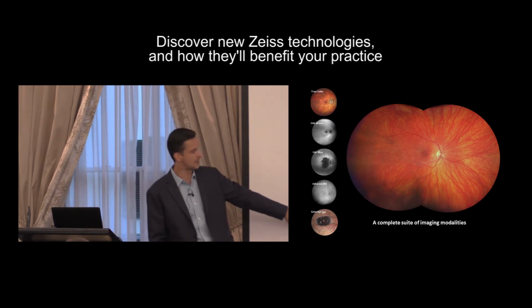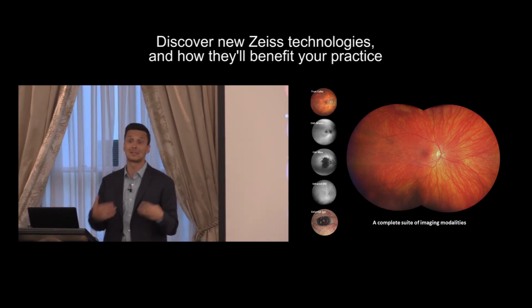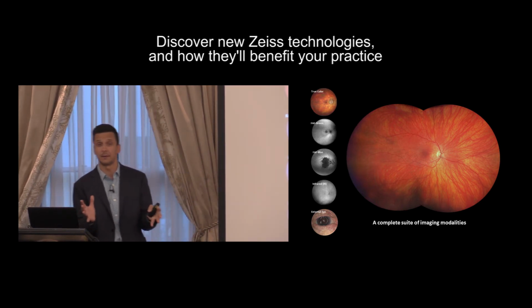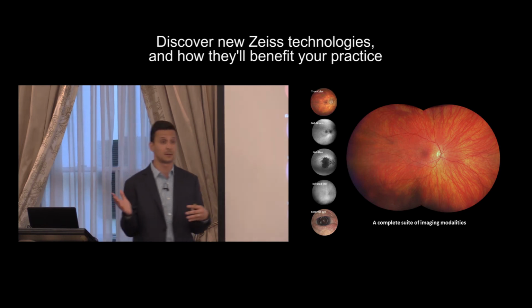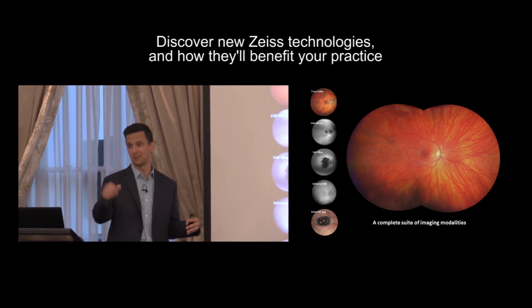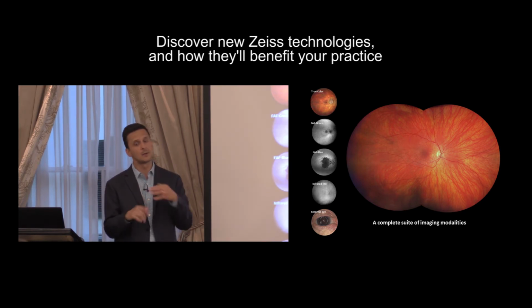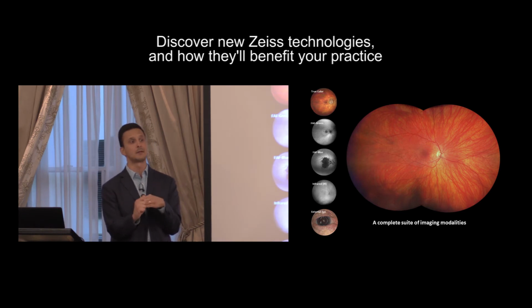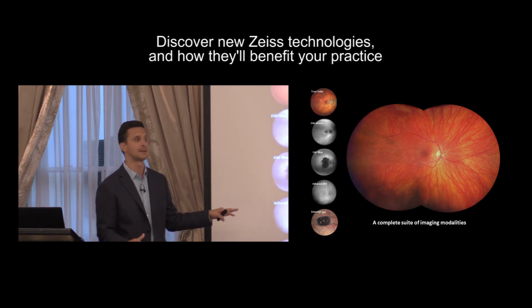The next piece here is this infrared piece that's down below. The infrared camera is used right now to sight the retina and kind of center on the retina. But what we found that was a lot of fun, and we started toying with, because we tend to go off on our own beaten path in the clinic, is we started playing with meibography on it. So we started flipping eyelids inside out and getting a white gland image. You can't do it with an infrared source that's coming from underneath like you do with a LipiView or a LipiScan. But you can get a white meibography image using the infrared light source that's on there.